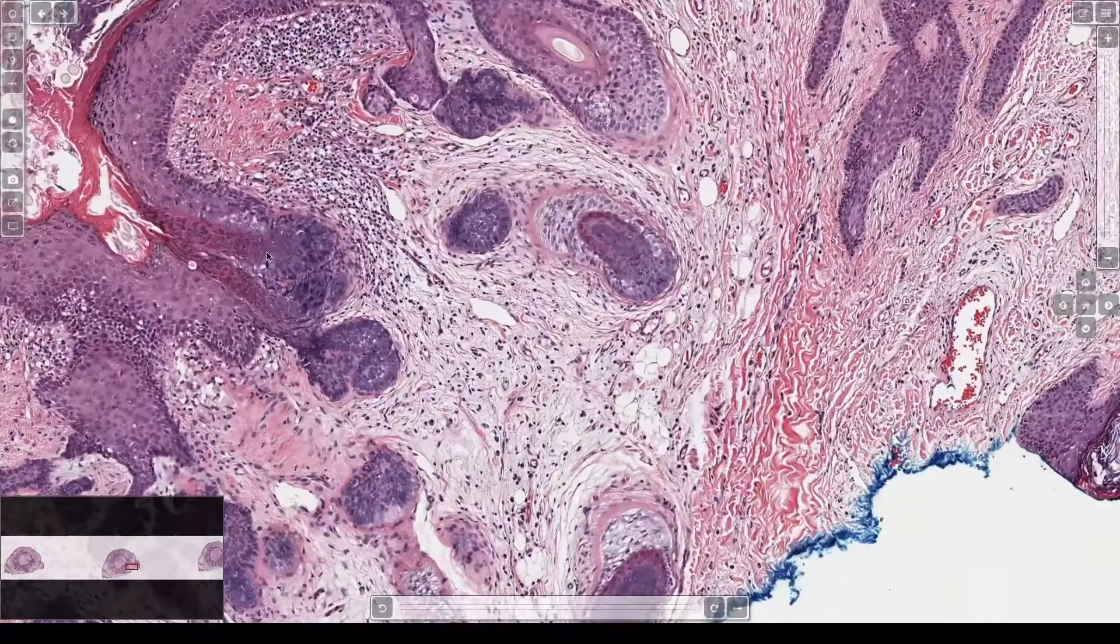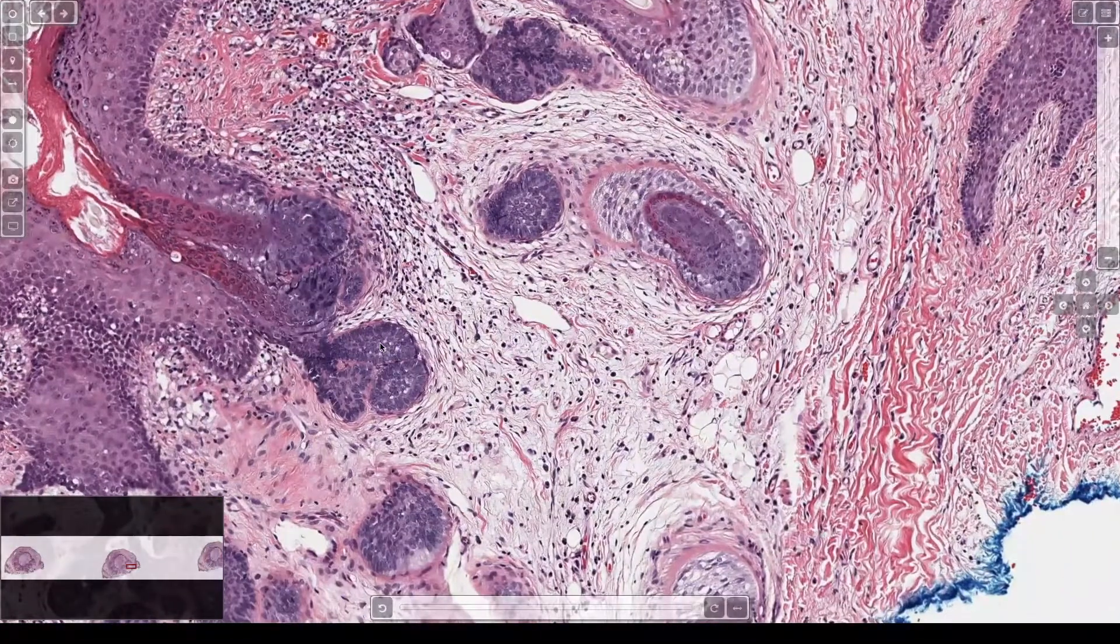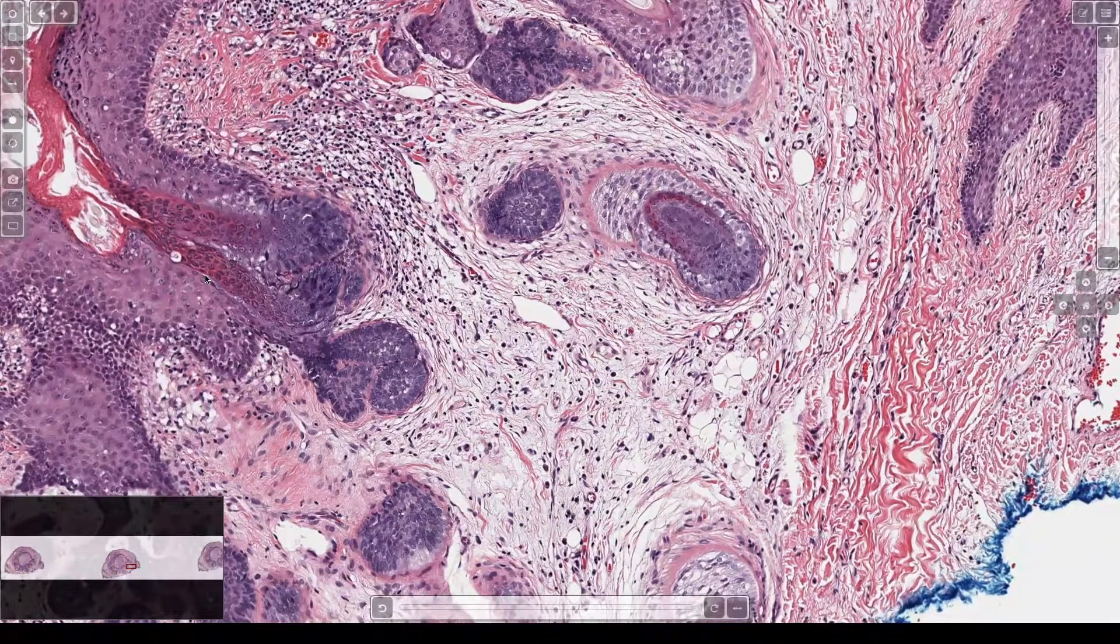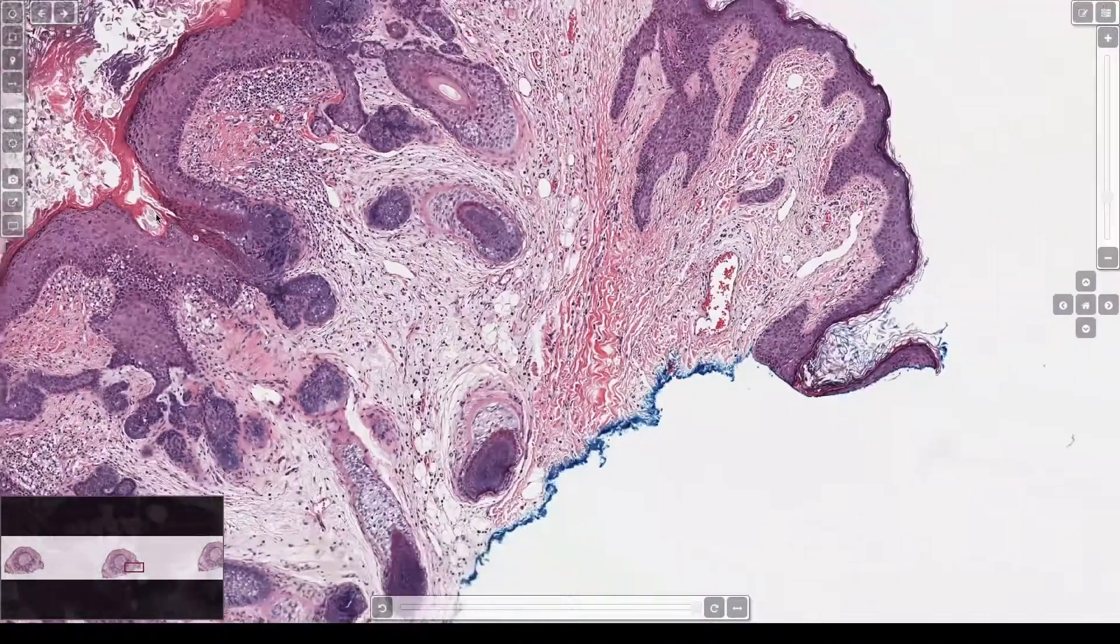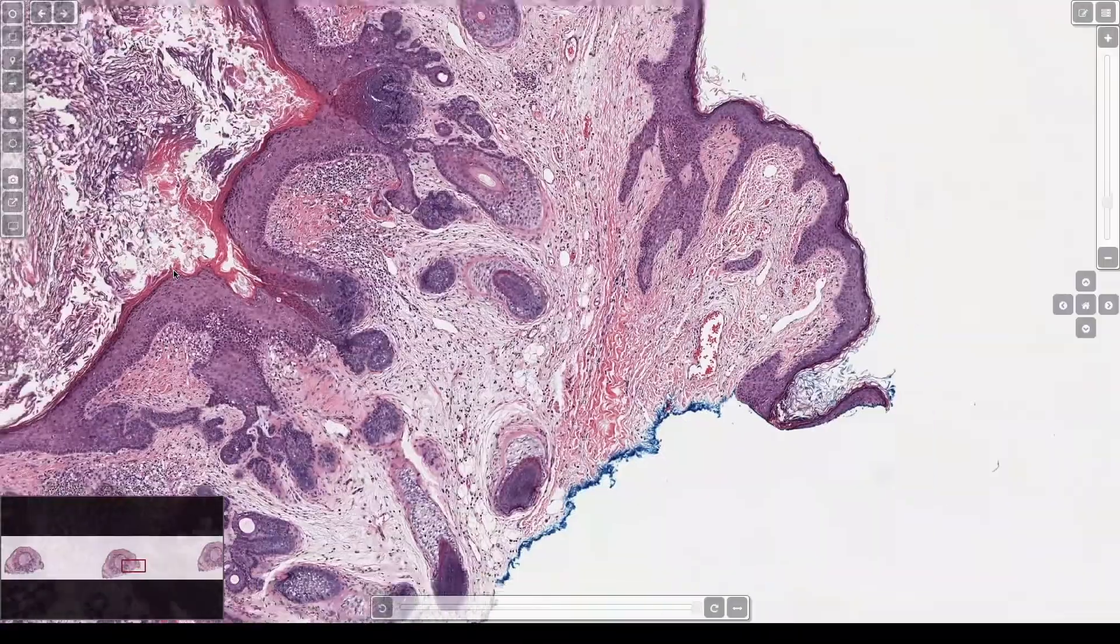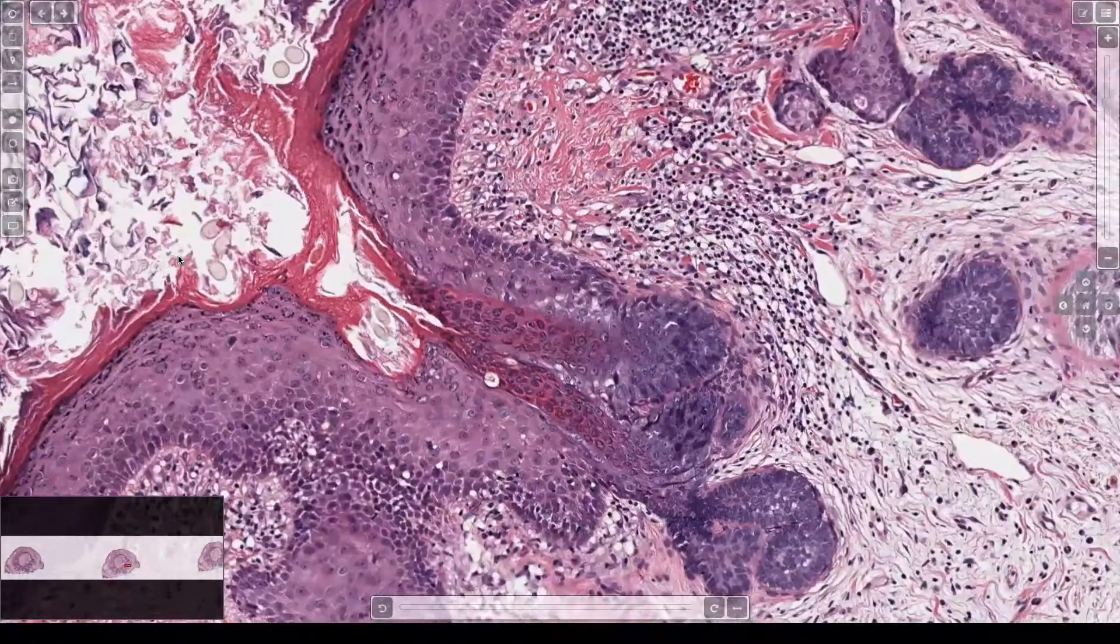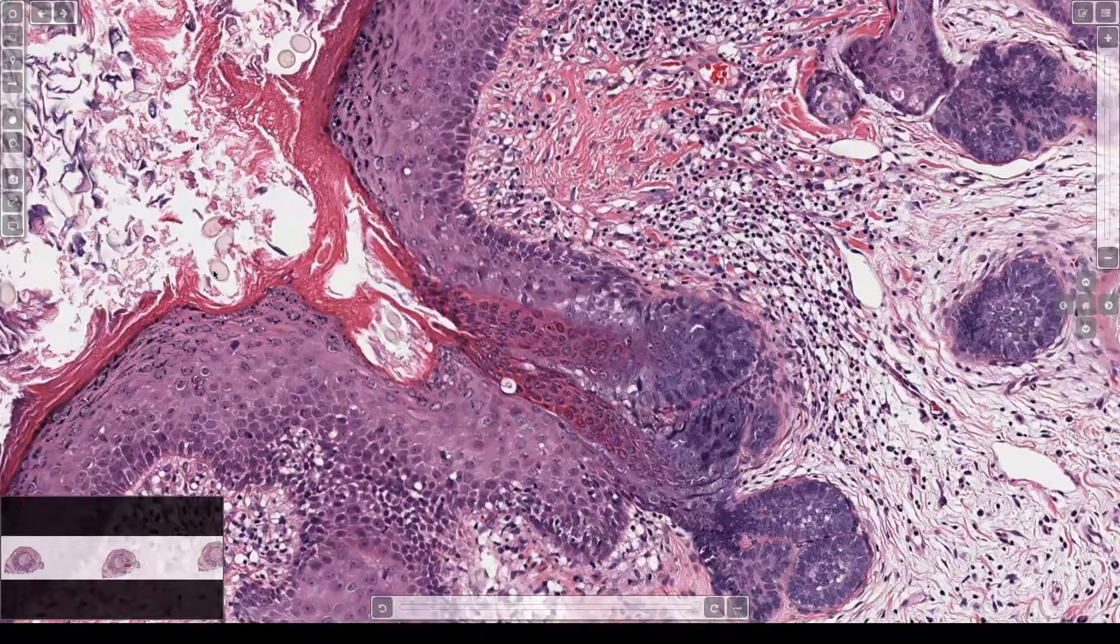And then looking around the outside, you can see little follicles and you've got matrical basaloid cells. You've got the inner root sheath with those beautiful bright red trichohyalin granules and they empty into the center. And you can even see there's a little hair follicle, I'm sorry, hair shafts in there too.